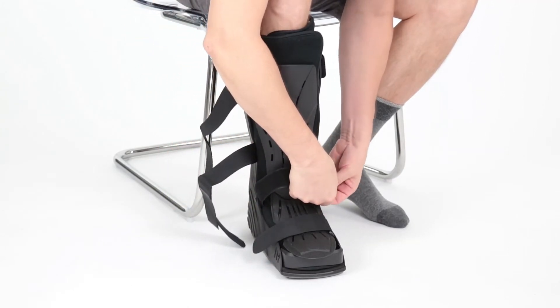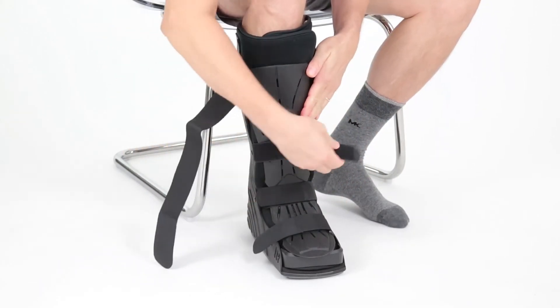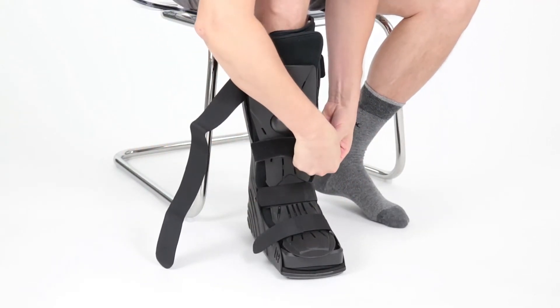Make sure the outer plastic splint is centered along the front arch of the foot, and the velcro tabs are secured at the top.